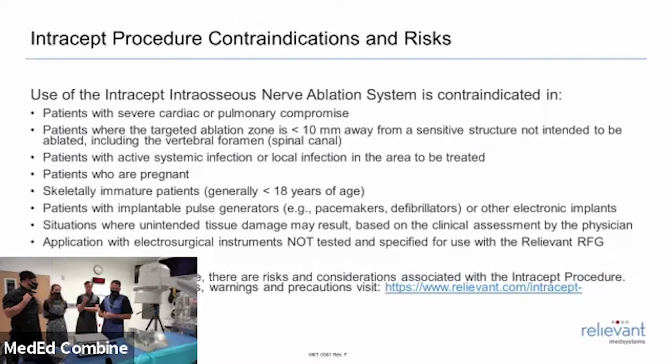And for the patients here, just a quick what you can give your patients. What I tell patients, based on the SMART trial, Fisherman's data and the Intracept trial that was recently published, I give them the rule of 75% response rate. Usually the pain is reduced 75% and it's durable or permanent, because the last paper that was published on durability, my first case is 6 years out now. Yeah. And so, the data is 6.4 years on the average and still going.